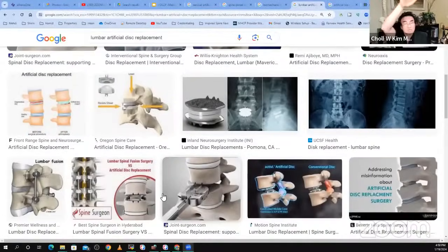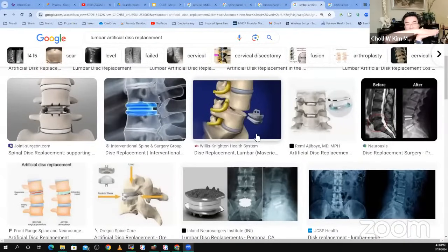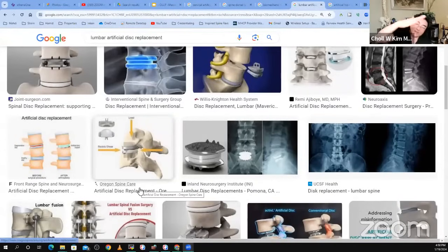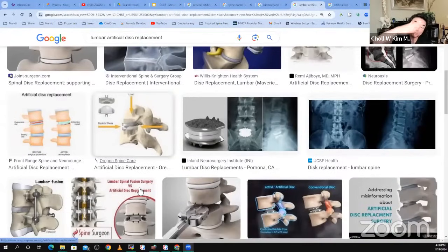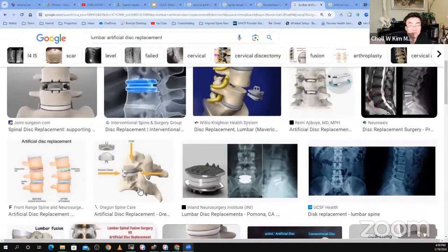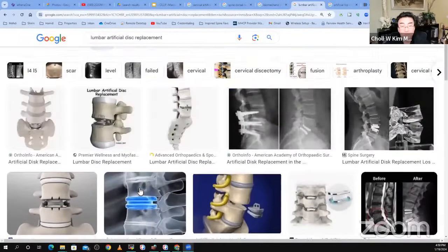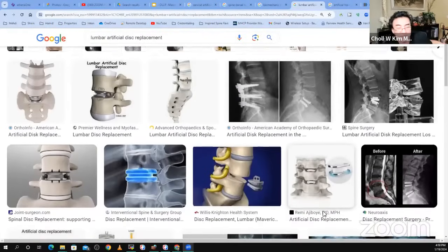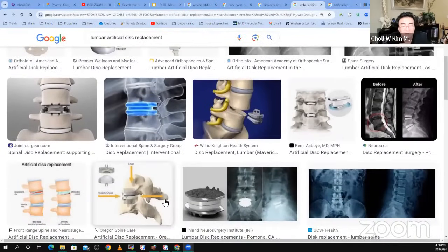If you have a patient where the disc is completely collapsed, like 0 millimeters, and you're worried that prying it open to 5 millimeters is going to be too much distraction, like overstretching something out, you don't want to put in a disc replacement device. You just want to do a fusion with a little short fusion device and not overstretch them out. That's an uncommon thing. I'm sure there's a few other reasons, but you can see how there's many reasons why not to do a disc replacement device.